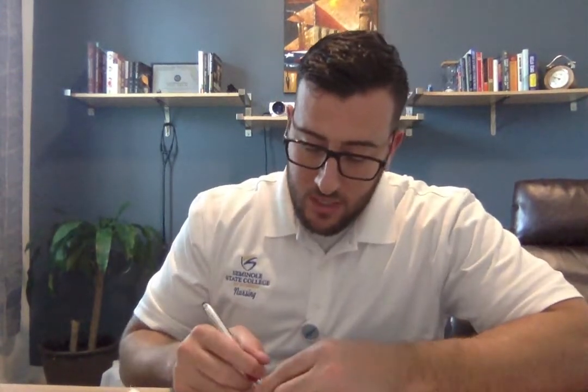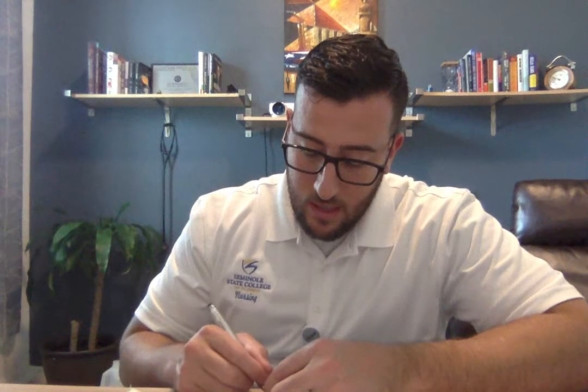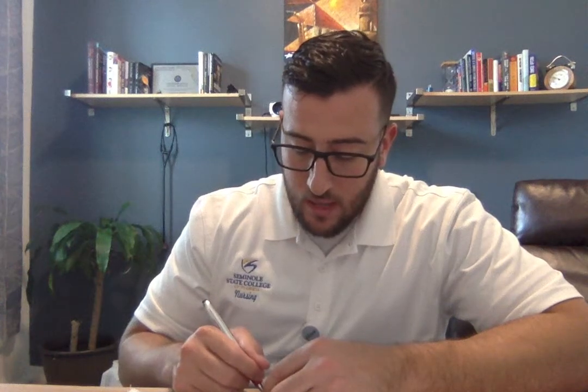I'm going to label the patient's name. So it's Anna Pavlovsky, flu vaccine, 0.5 mLs, my initials, today's date, which is 5/11/2020, and then the time, 1458.